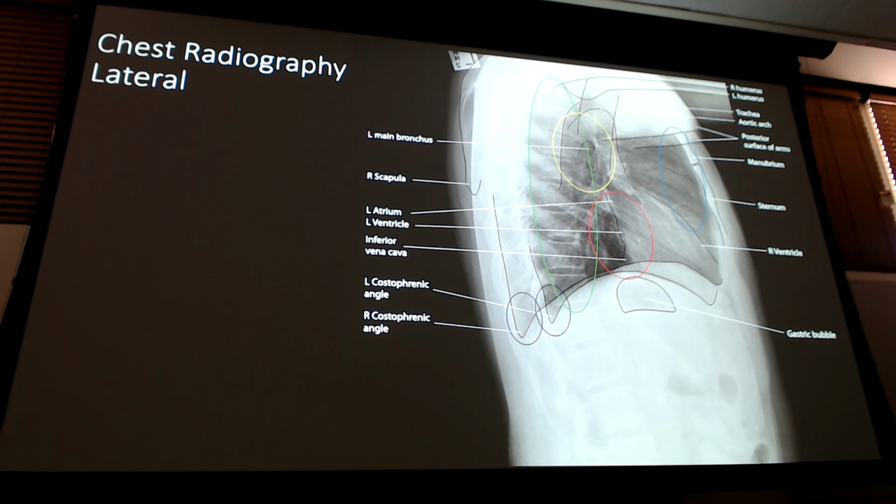Retrocardiac space right behind the heart should be darker. Why should it be darker? Well, because the radiation's taking all this. There's nothing here. There's air compared to a bunch of tissue and bone and everything. It's going to look a little darker. That's normal, right? So now I have my hilar region behind my hilums right in here. Okay, right in here. I can now see all that where I couldn't before.